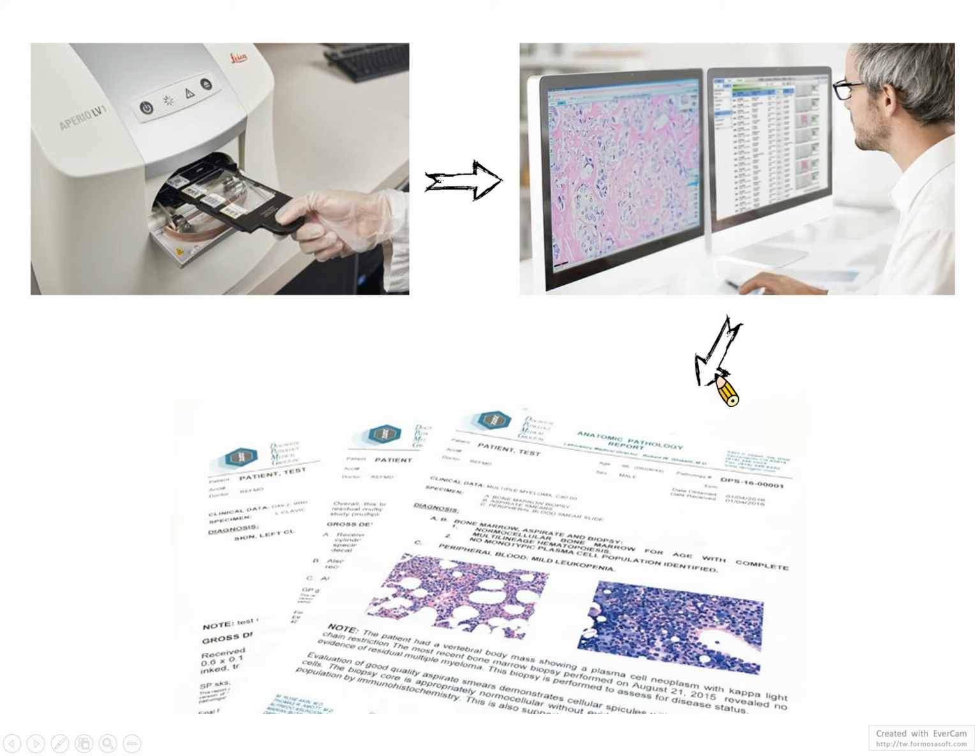But imagine if you can use machine learning or AI to identify these things, that would be more powerful. Because if you are a doctor working very late in the midnight, you will probably miss a tumor.